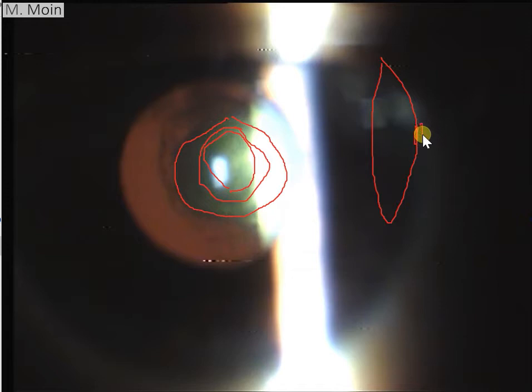And the posterior capsule is deficient in this area in some patients or most of the patients depending on what is the grade of posterior polar cataract.